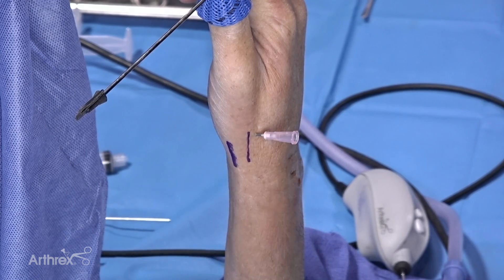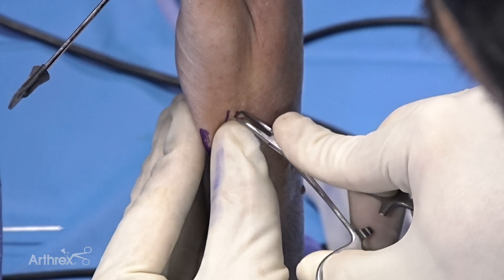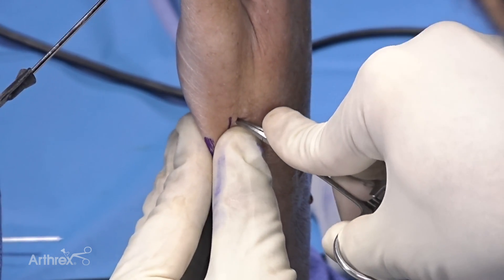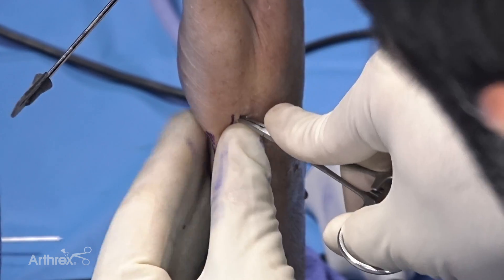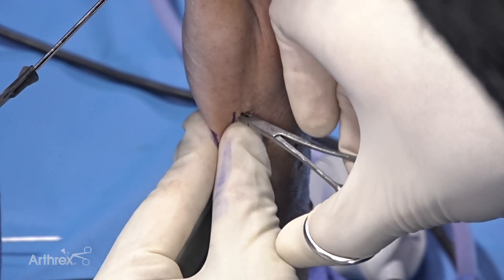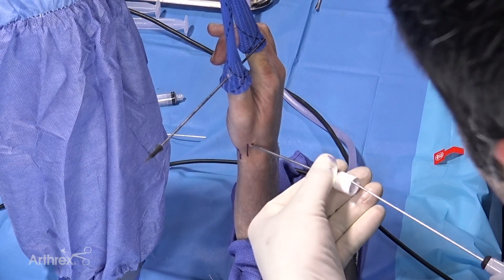You can also make a 1R portal or a transthenar portal to give you some working length. Structures at risk here are the dorsal sensory branch of the radial nerve and also the radial artery, so you really want to take your time to spread down and pop into the joint. If you're not sure, you can always take an x-ray to make sure you're in the correct joint.